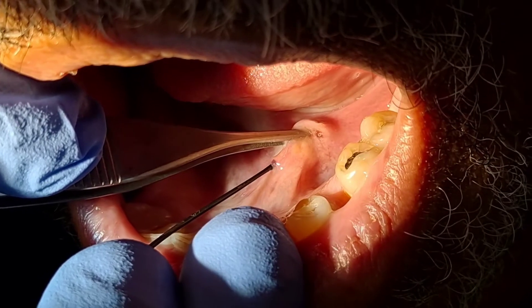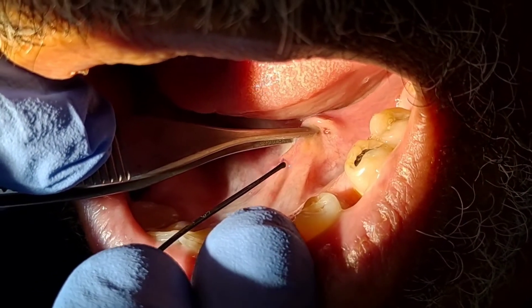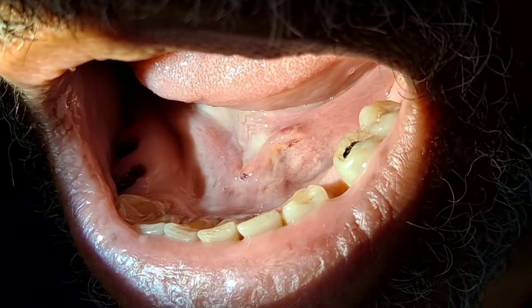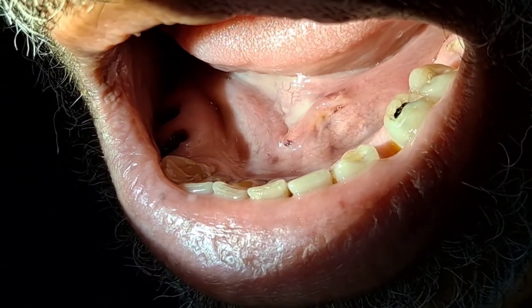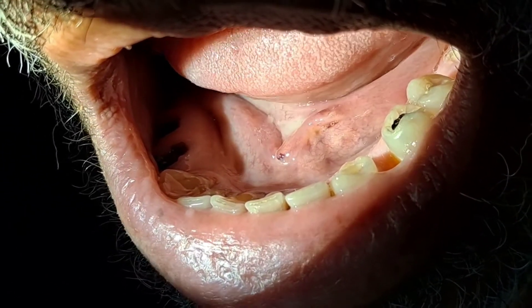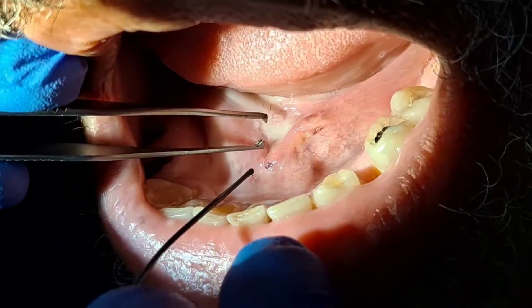The problem with this case is that the stone was right at the tip, so it wouldn't let us dilate the duct. The duct wouldn't open since the stone was right behind it and wouldn't let the dilator pass by.